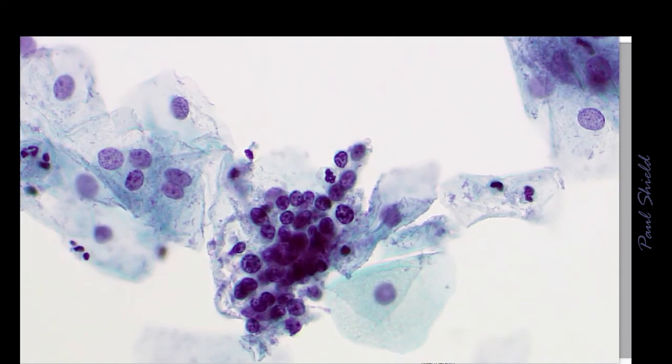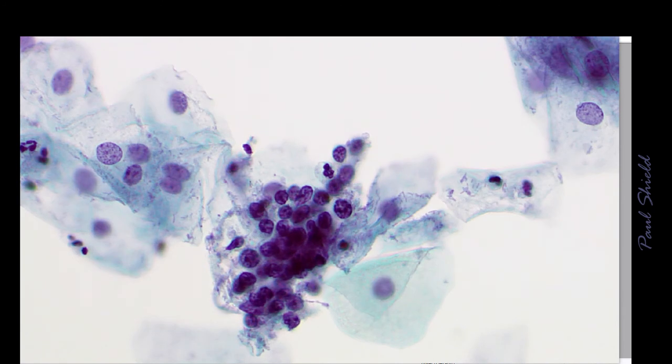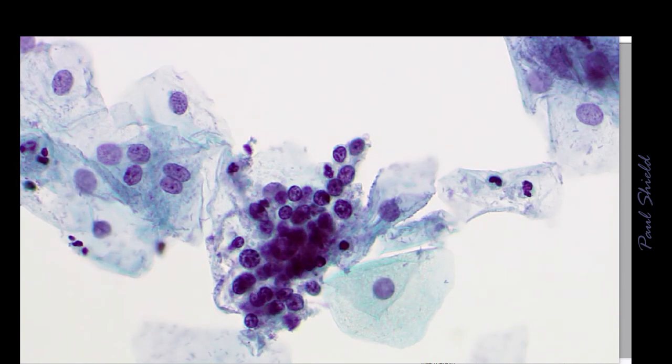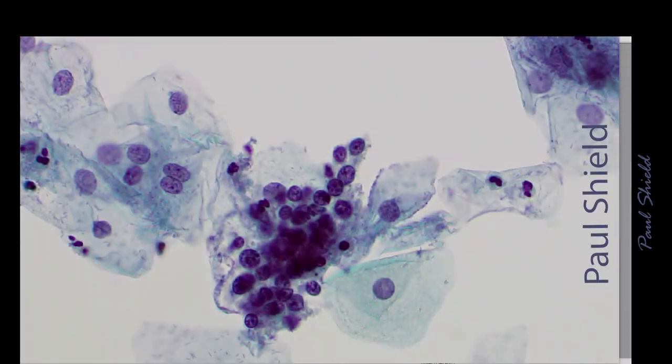This is a tricky mimic of high-grade cell. This is lymphocytes, so in follicular cervicitis. They look hyperchromatic and it's difficult to see a cell border on them, so it's hard to evaluate the NC ratio, but it appears to be quite high.